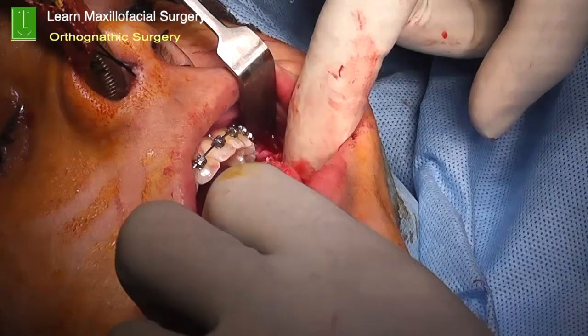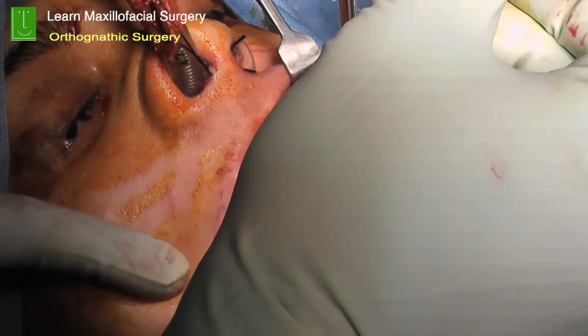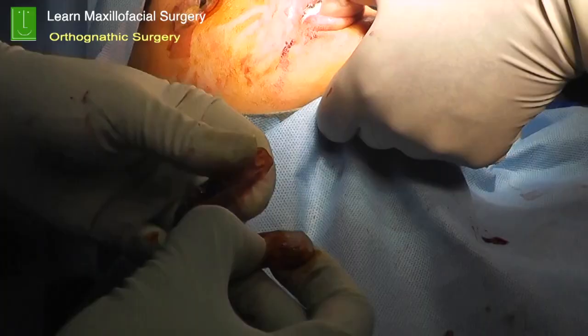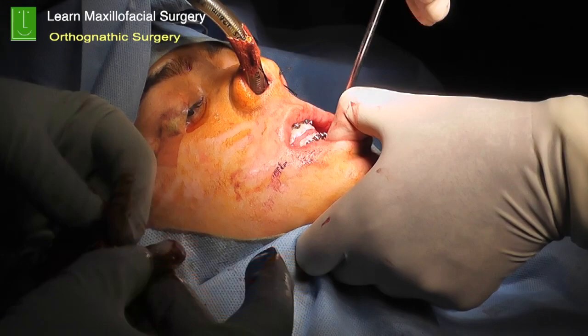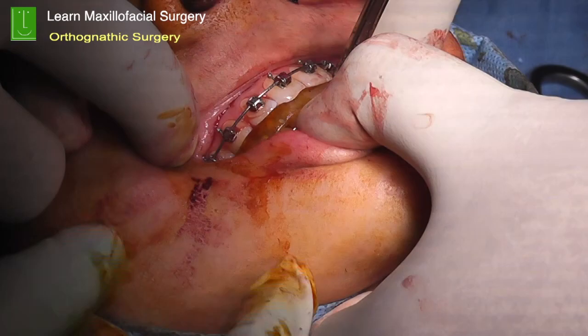Now you can check the occlusion, how much you would like to take it back. Again, if you have a preoperative splint, that can be extremely useful for you to guide the movement, how much of setback you would like to do, and that's the guide, the splint which we have done. If it's a single jaw surgery, then there is only one splint. If you're doing a bijaw surgery, then you will have to have two splints. So with this splint in position, get the occlusion right and then fix the teeth into intermaxillary fixation. So it's very, very important that you get the occlusion right with the splint in position.